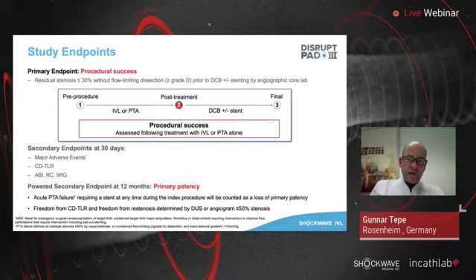Normally, we don't know how to treat those with high pressure balloons, with stents, whatever. In that study, we compared IVL and PTA, and then the images were analyzed by a core lab. In addition, afterwards, a DCB or a stent was placed. Everybody received DCB, and in some patients stents were also necessary.